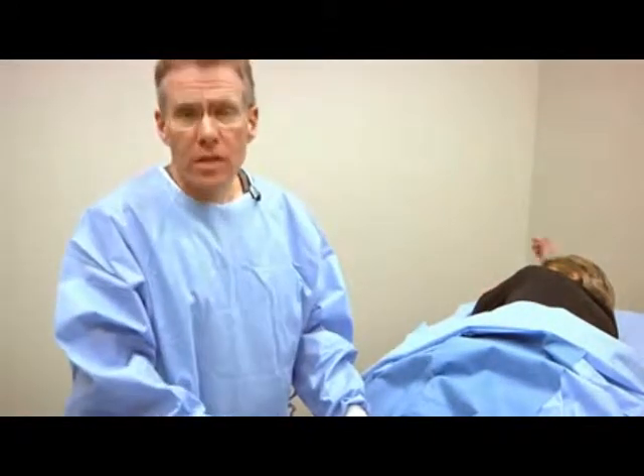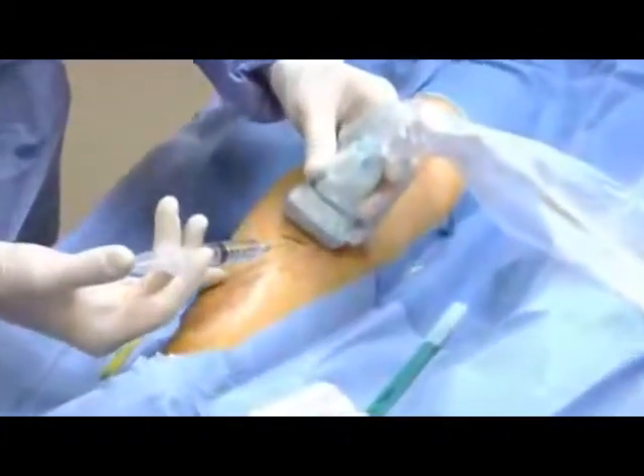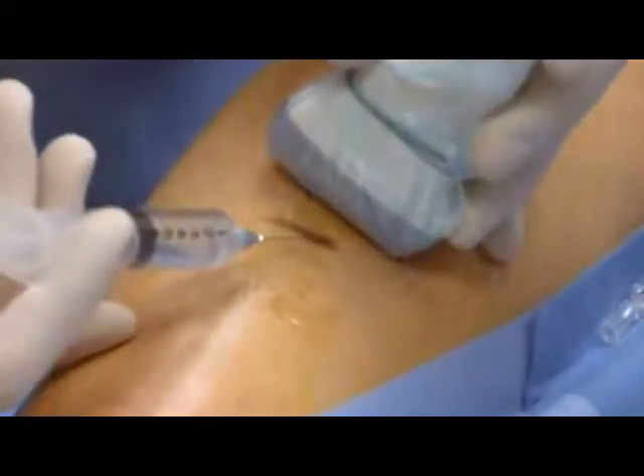This whole procedure is done as an outpatient in an office setting, taking about an hour to do. We do not use general anesthesia. Some patients require a small amount of valium or relaxing medicine, but in general it's quite painless. So we'll proceed with introducing our catheter into the vein on the back of the leg. The first step will be to put a little bit of novocaine in the back of the leg.